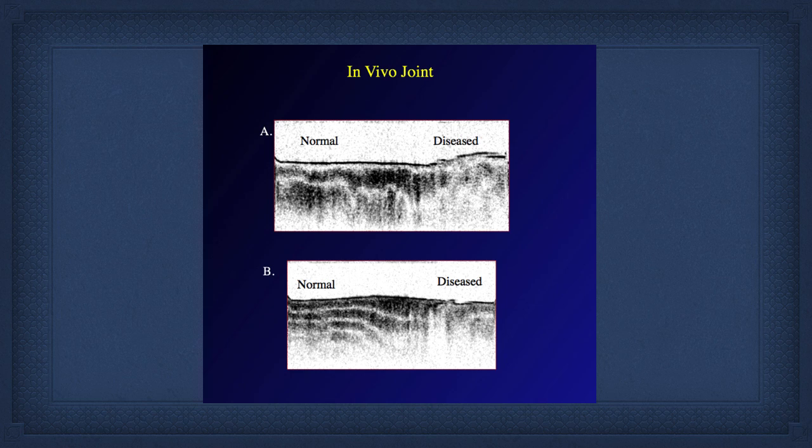So this one, we have a nice banding pattern. The orthopedic surgeons love them. They don't want numbers. And so, no, that's normal. Now, on the upper left, it says normal, but it's really sort of slightly abnormal. The collagen is starting to get disorganized. And so this is early osteoarthritis, and I'm showing you cartilage just to illustrate the point. And then on the right, the collagen is just completely disorganized, and you've lost the birefringence.